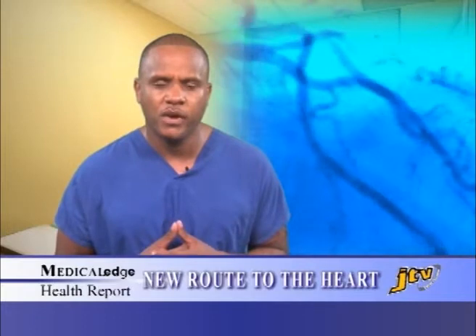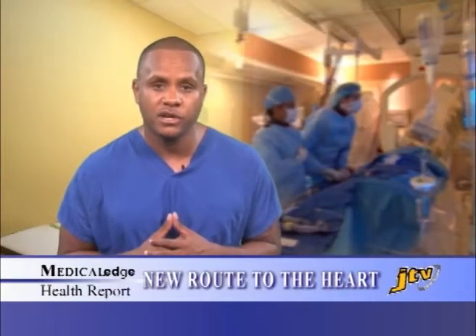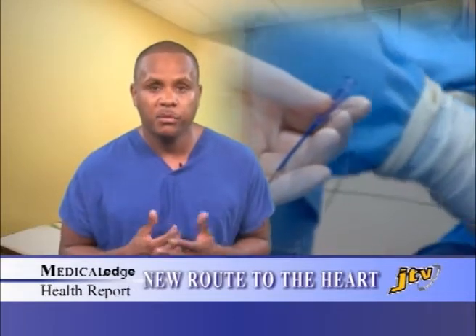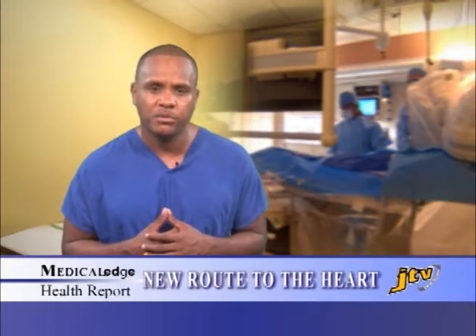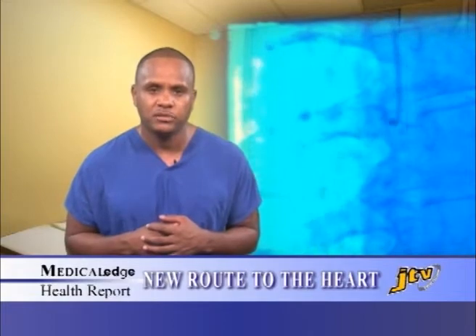Dr. Gulati says if you need a stent, there's no guarantee you can have the radial artery procedure. Only people who have good blood supply to their wrists and arteries that aren't too small are candidates. Also, some people who have bypass can't have the procedure because wrist arteries are sometimes used in the operation. But for the right person, this procedure can be very beneficial.